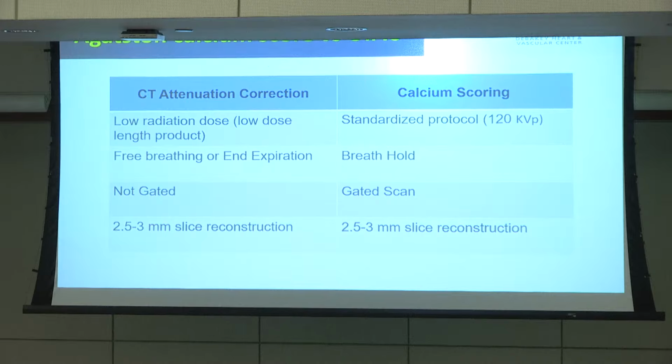And it's very important for all of you, as SPECT-CT becomes more available, to gain the expertise to interpret these incidental findings on these low-dose CTs. They're usually going to be major findings. We're not talking about a small granuloma here and there. We're talking about a 5 centimeter lung mass, or a large pericardial effusion or pneumothorax.